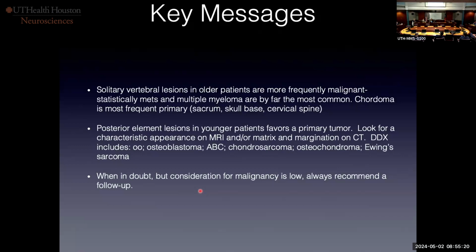We've had 3 cases of post-chemotherapy bone infarcts here in the lymphoma patients. I'll send them to you. You will see a geographic pattern. It's very typical. I wish I had brought it, but in the case that we had, the central part of the lesion is high signal in the T1 weighted image. What makes it look odd is there'll be this geographic low signal on the T2 outlining the lesion. That leads you to believe that it's a bone infarct.